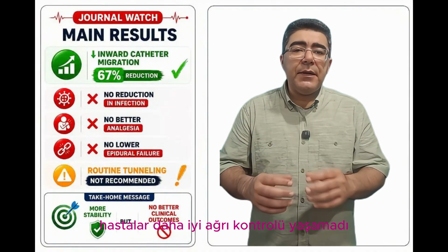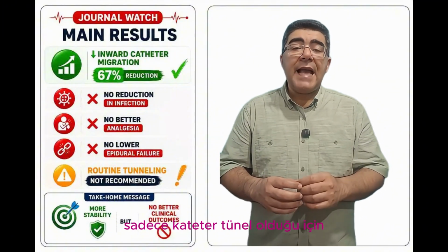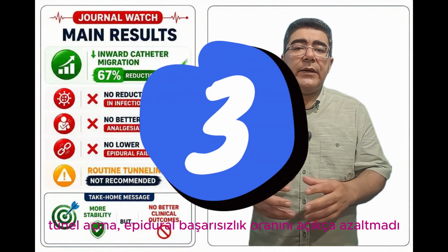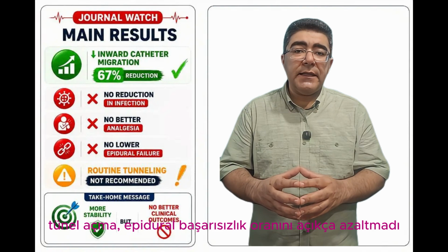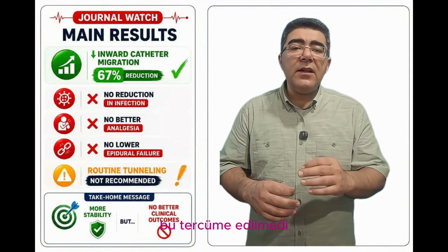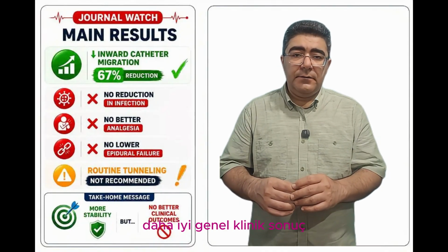Patients did not experience better pain control simply because the catheter had been tunneled. And third, tunneling did not clearly reduce epidural failure rate. Although catheter stability improved, this did not translate into better overall clinical outcome.